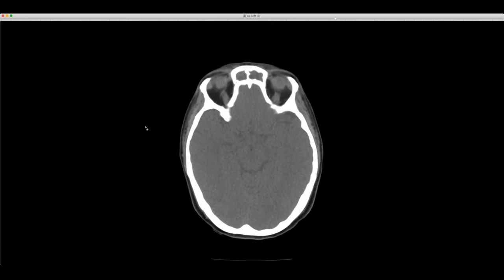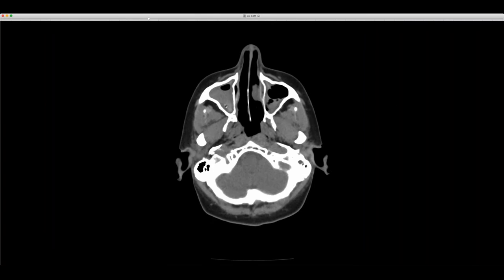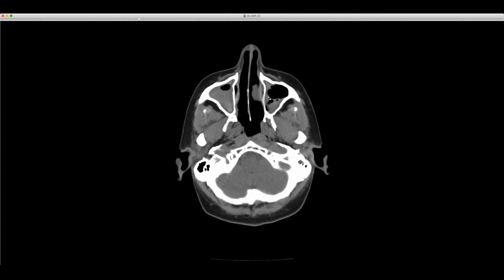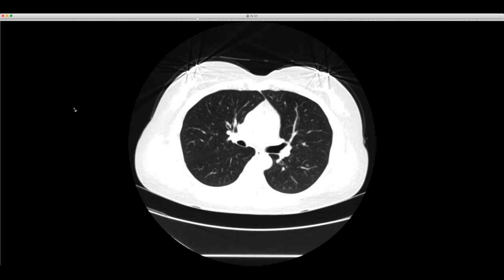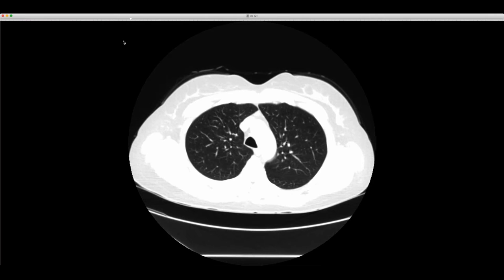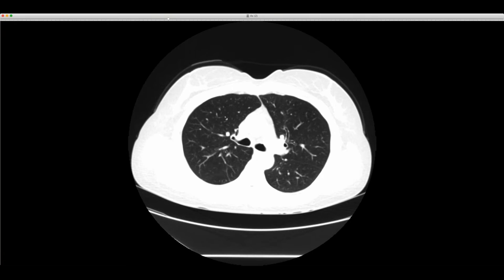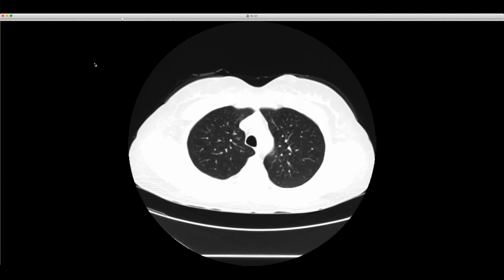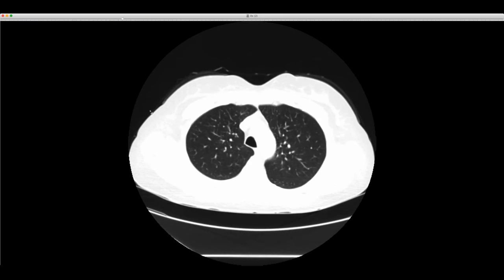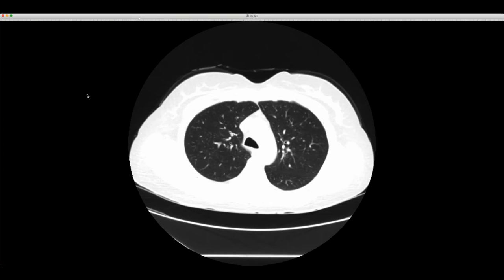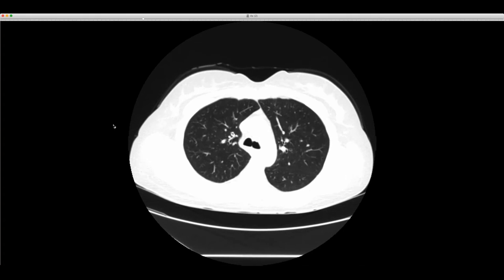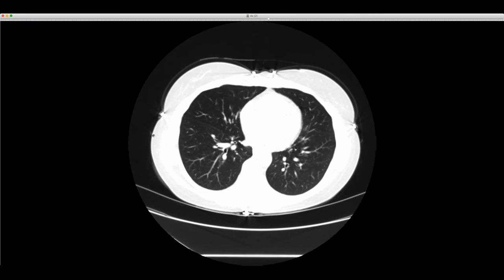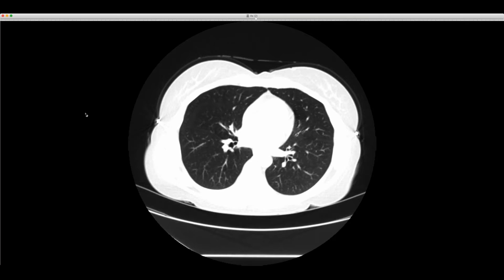This patient — let's take a look at another study — on a CT they had done, they had a lot of sinus disease here. This patient also has a peripheral eosinophilia, about 15 to 20 percent of the total differential. And there's an outside CT that apparently shows ground glass fleeting opacity. So this is a patient with Churg-Strauss syndrome who has four of the six required diagnostic criteria: sinusitis, asthma/eosinophilic bronchitis, fleeting airspace opacities, and peripheral eosinophilia.